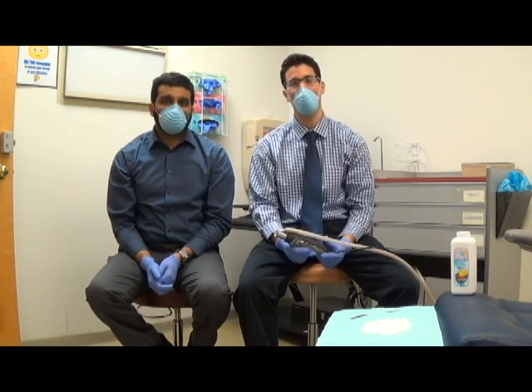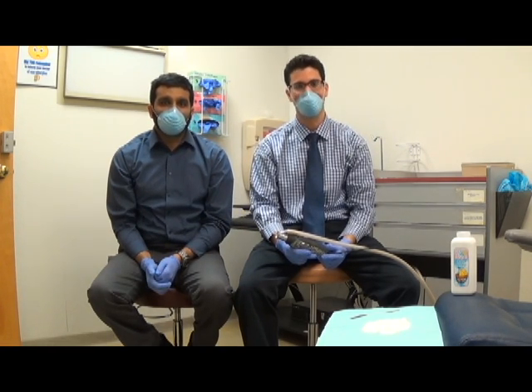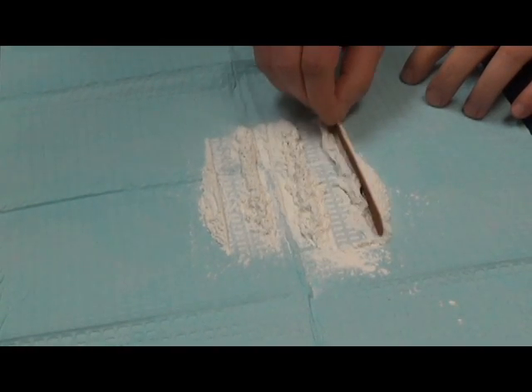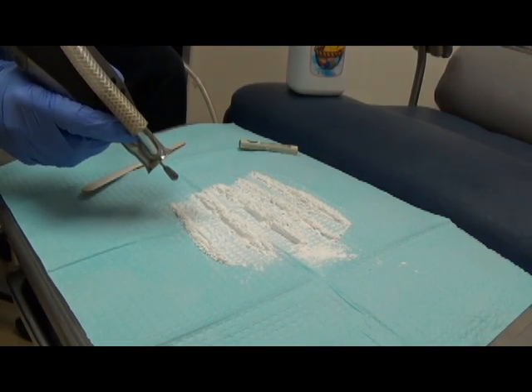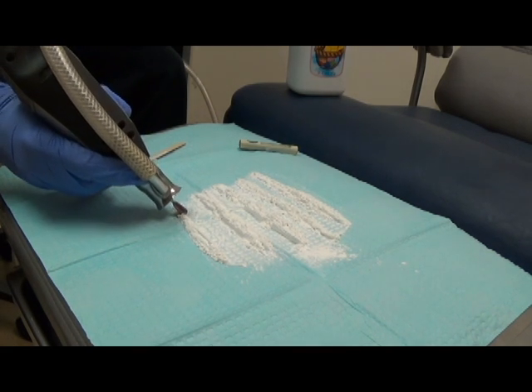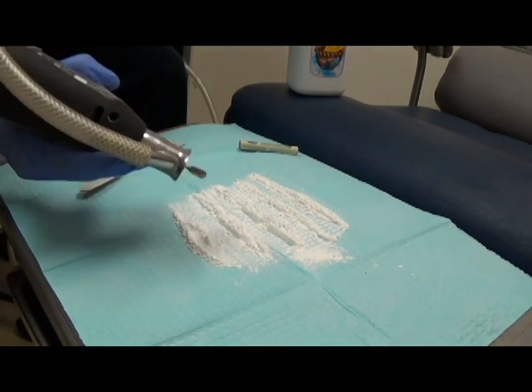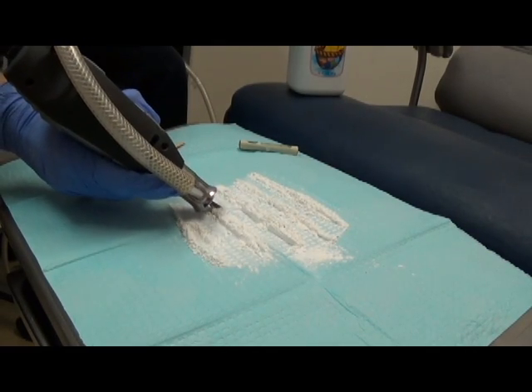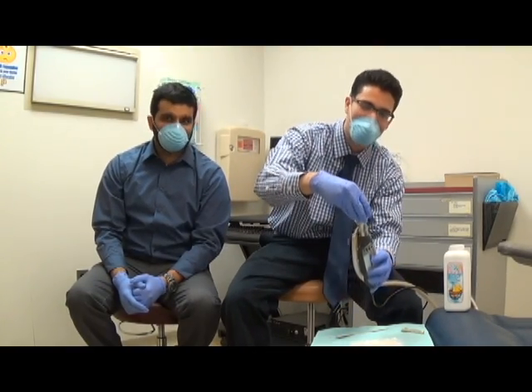I prefer not to have fungal balls in my lungs and brain. That does not sound like fun. Now that we have our PPEs on — protective personal equipment — we're going to test the efficacy of the vacuums. We have here on the table real, 100% authentic fungal toenail dust. The moment of truth. So it appears that this may be effective if the toenail fungus is actually scooped and placed directly into the vacuum.